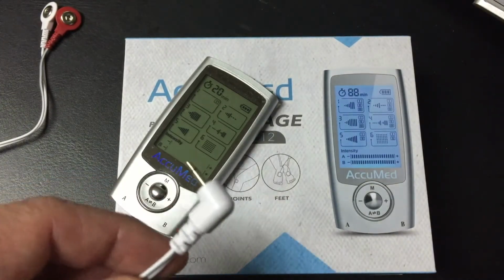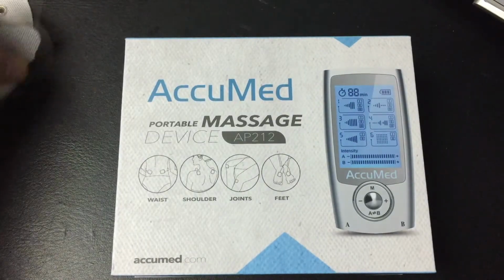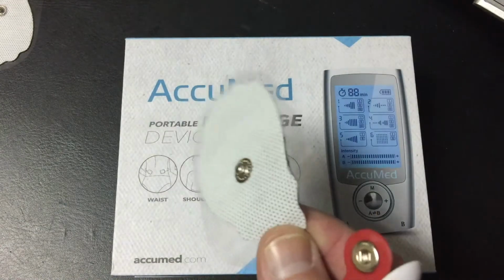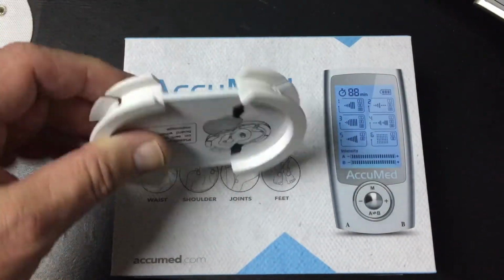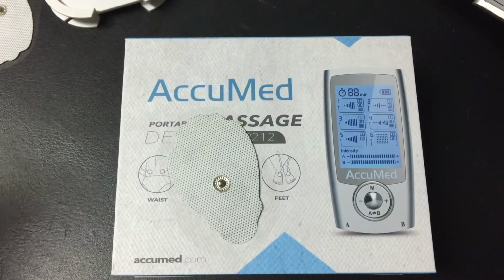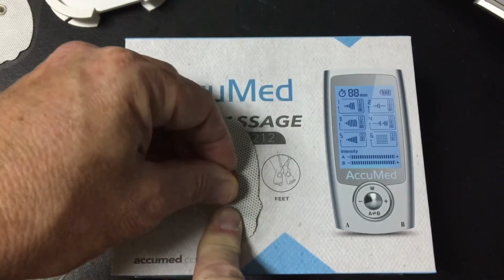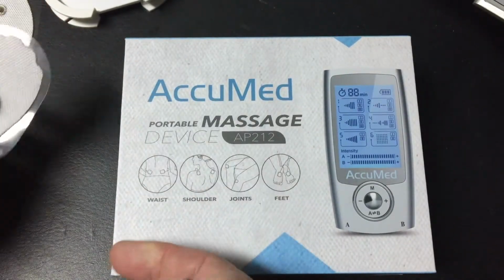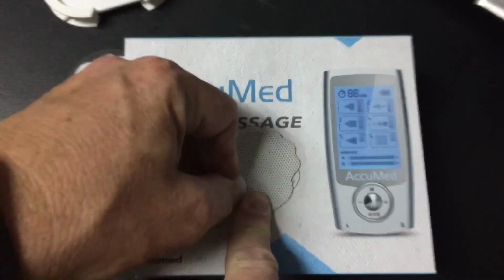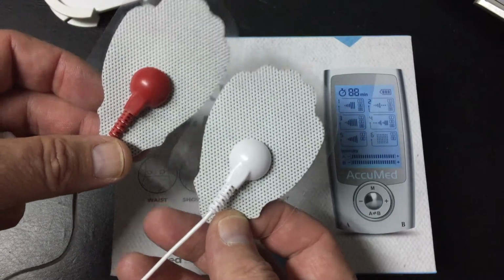Now let's go over connecting your electrodes and your pads. Normally with the pads, I leave them attached either to the piece of plastic they came on, or if I'm already using them, I leave them attached to that. It makes it easy if you lay this on a flat surface. You just simply snap it on, just like that. Now we have two electrode pads attached to the electrode wire.